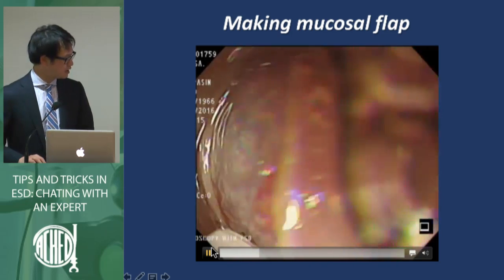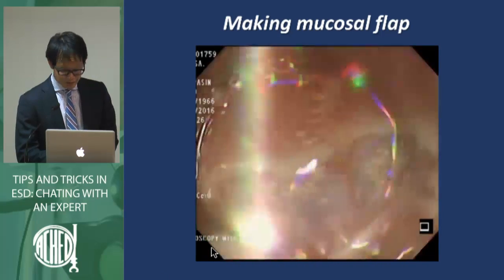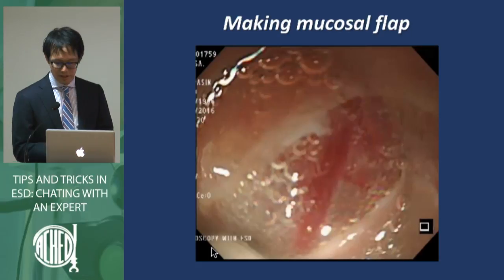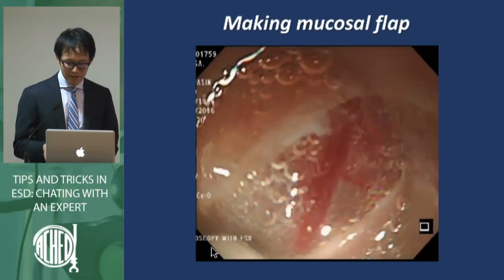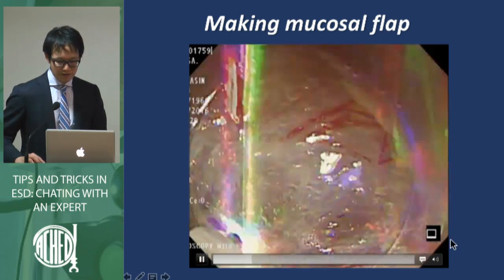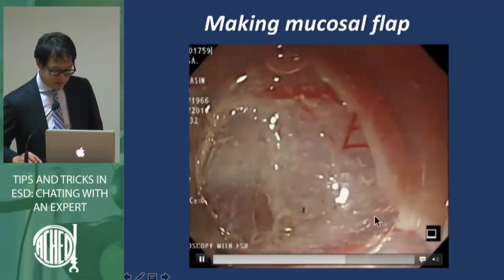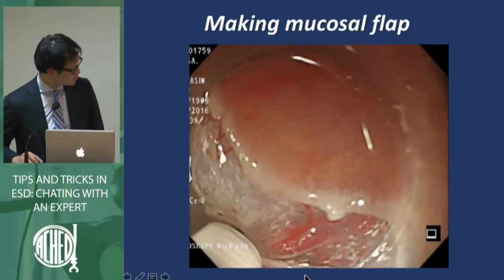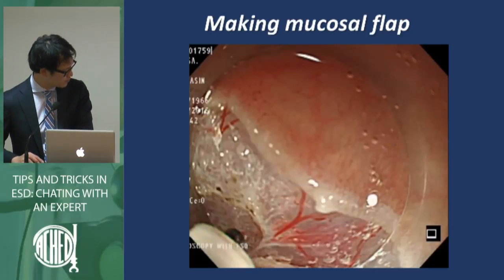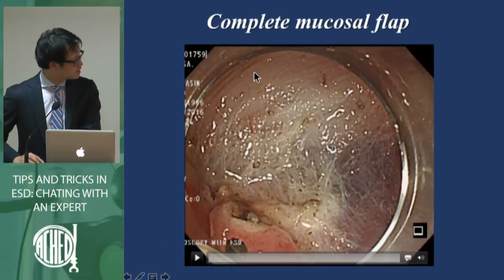And then we conventionally make a mucosal flap. Next, this is prepared to make a mucosal flap. We cut the edge by stroking back and forth. And then we repeat cutting just above the muscle layer. You can see the muscle layer. You can cut just above the muscle. This is the muscle layer.